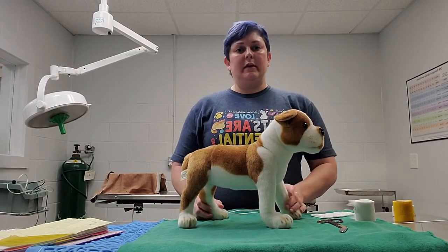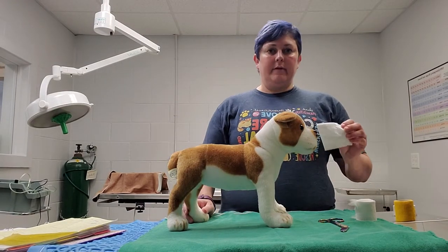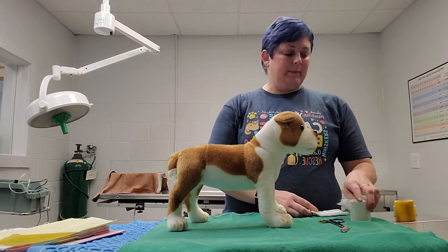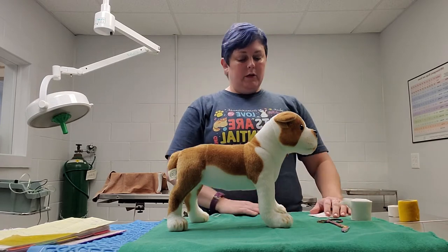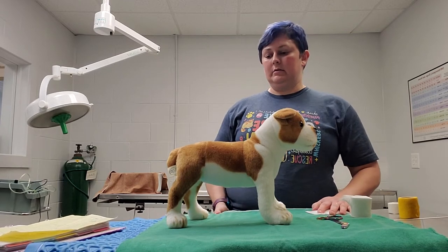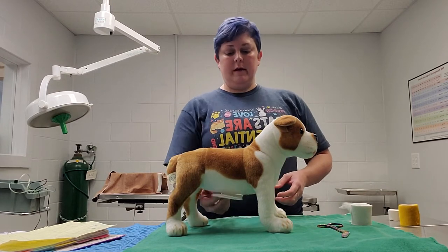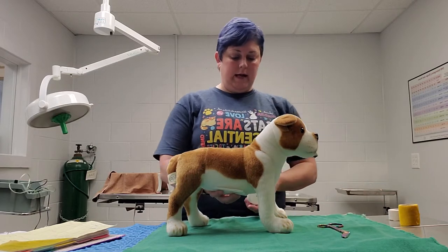My name is Cassie Thresher, and I'm doing a video on how to apply an abdominal bandage. We don't have ABD pads here at the clinic, so I'm going to use a makeshift ABD pad, some cast padding, some vet wrap, some tape, and some scissors. We're going to start with the ABD pad on his belly and then do the cast padding next.